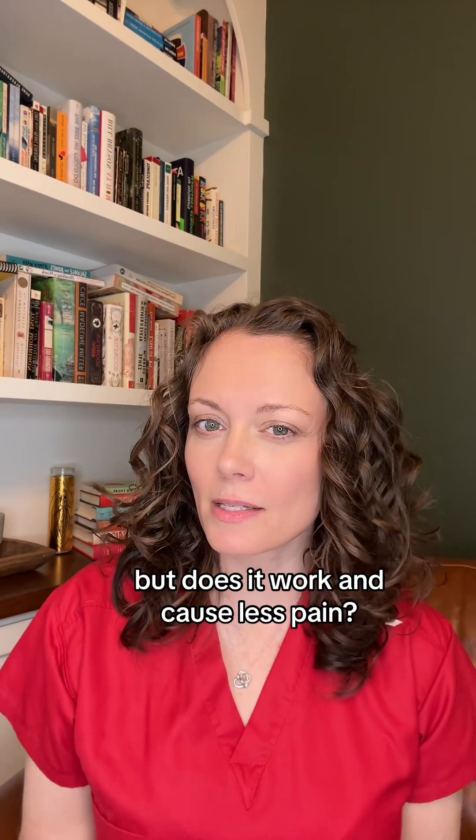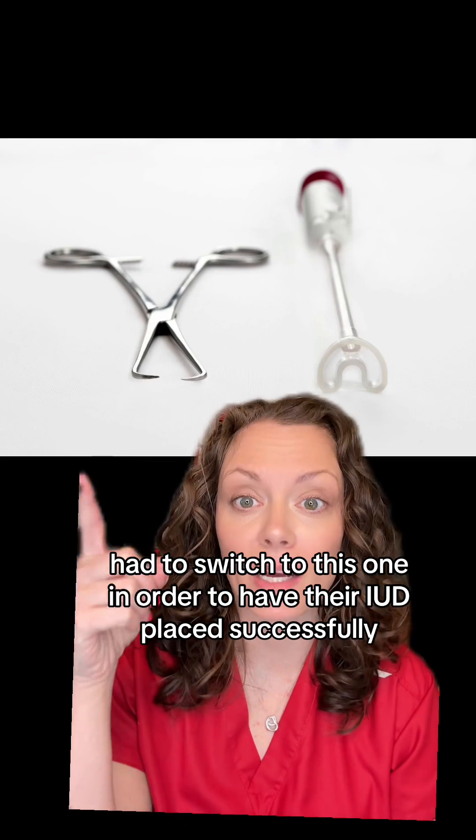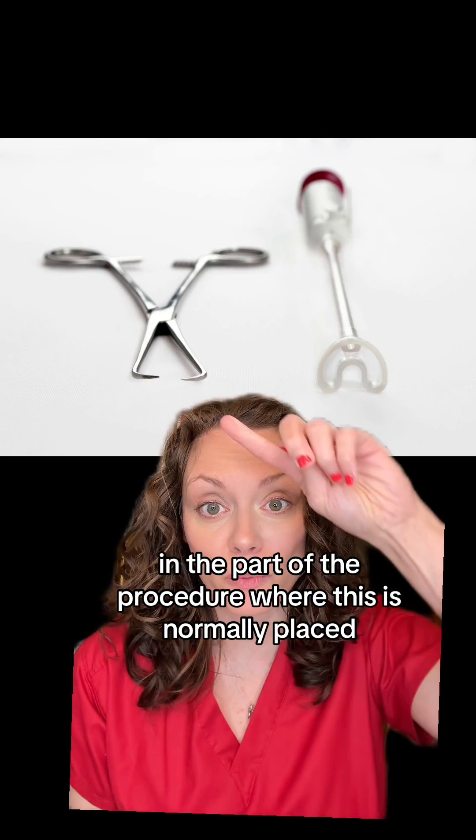But does it work and cause less pain? Let's see. This was studied in Switzerland last year, and some people who had the CareVix had to switch to the traditional tenaculum in order to have their IUD placed successfully. Out of 64 devices, 21 were defective. But it did show less pain at the point in the procedure where the tenaculum is normally placed — people said this was way more comfortable.